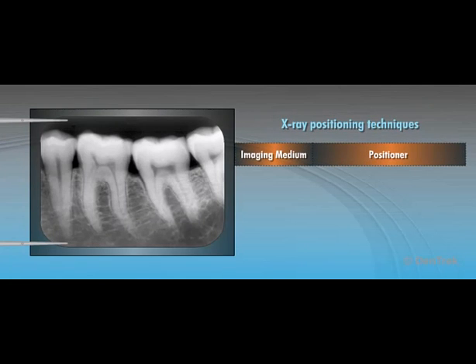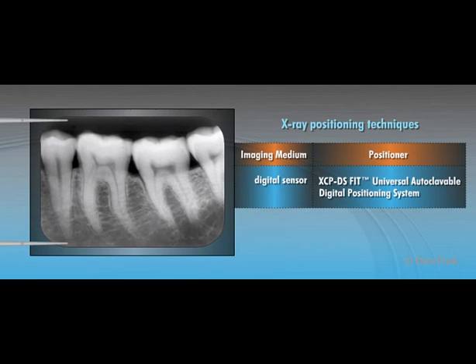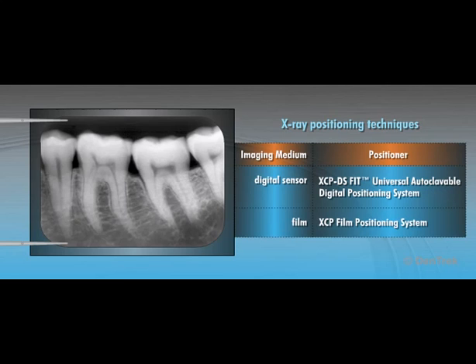Please note, during this training module, we will be demonstrating X-ray positioning techniques using a digital sensor and the XCP-DS-FIT universal autoclavable digital positioning system with a RIN X-CP Aura 3-in-1 ring and arm. If you are using film, you can apply the same techniques using the X-CP film positioning system.